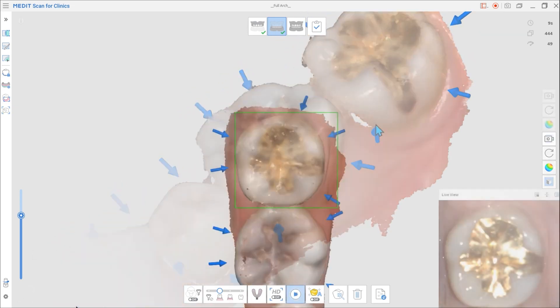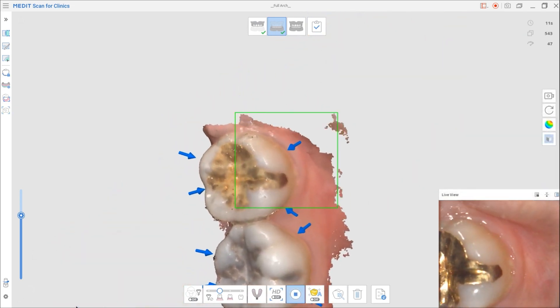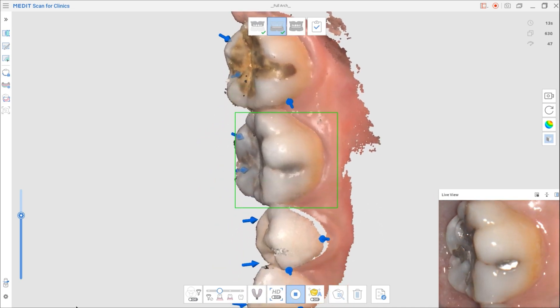The arrows automatically disappear when you scan again, improving the data reliability.